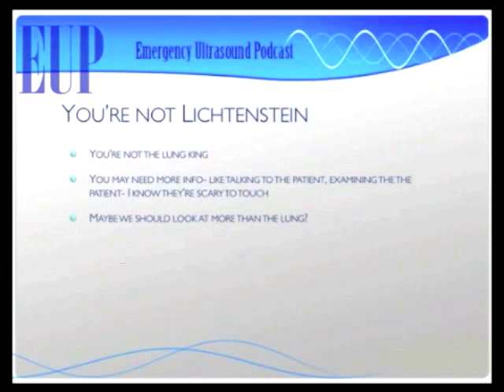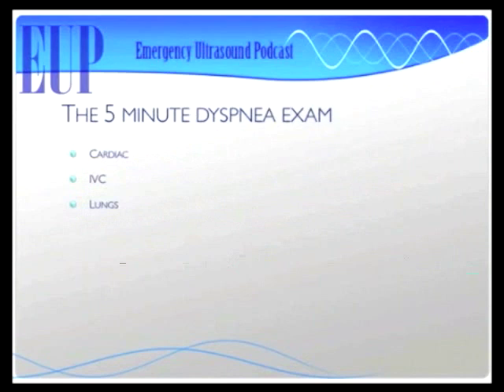Right. So my idea is that we actually use the cardiac exam, the lung exam, and the IVC exam, and those three things together we can help him get an impression as to why the patient is dyspneic.